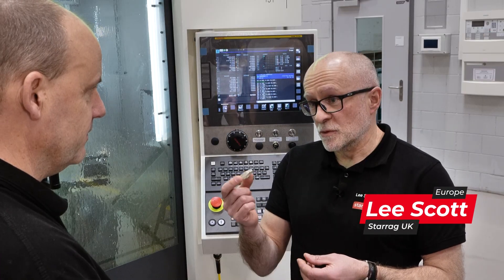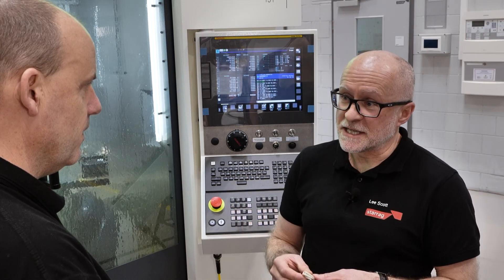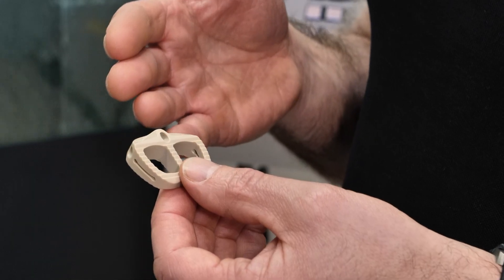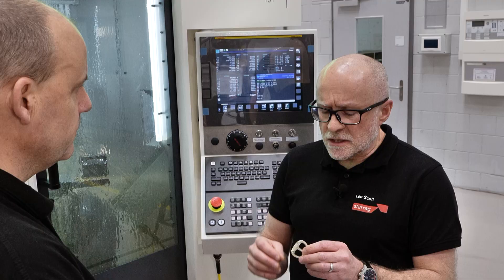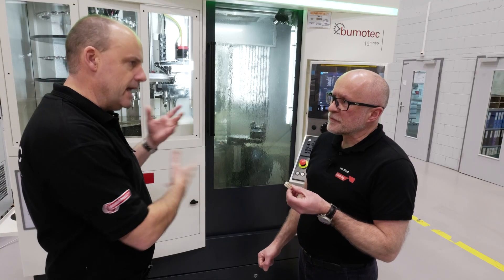This is a spinal cage, which effectively fits inside your spine to replace a disc. The material is called PEEK — it looks like a piece of plastic, but PEEK is a material widely used in the medtech industry and the body doesn't tend to reject it.